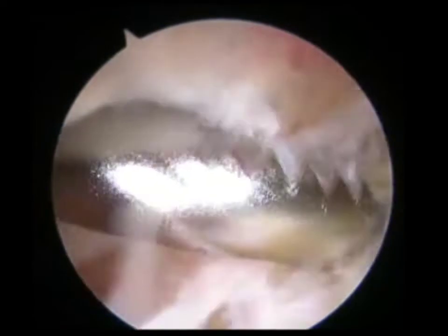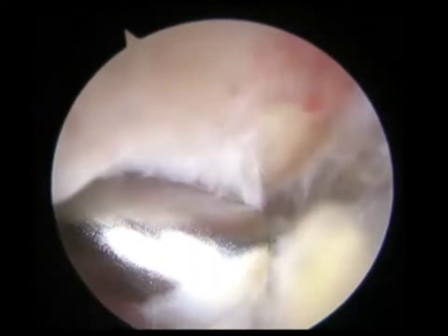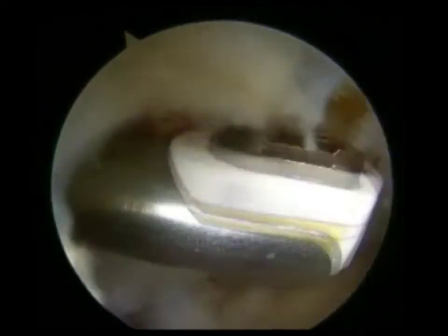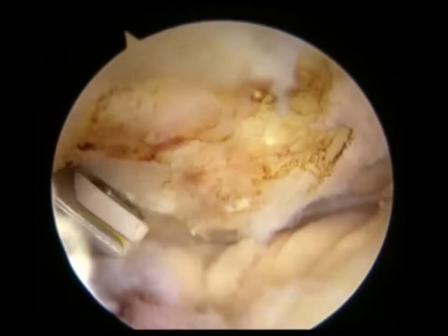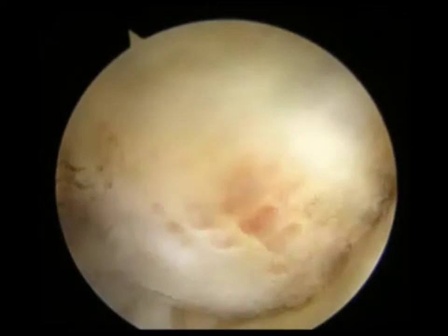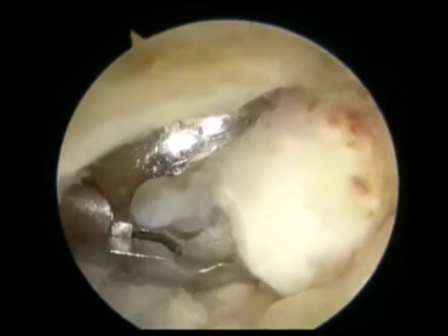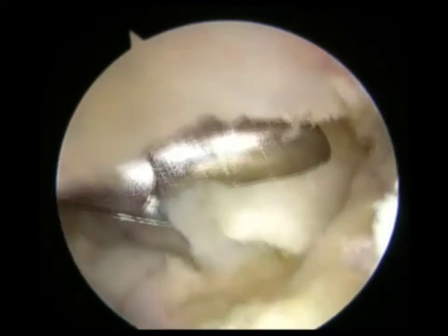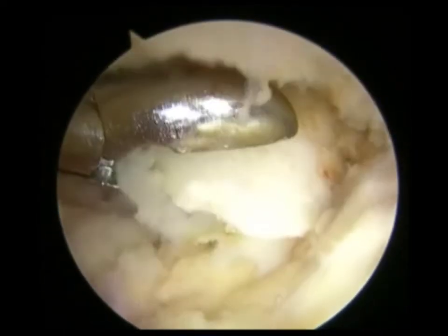After identification of the ossicle, debridement of the bursa around the ossicle is performed with a shaver and radiofrequency device. The ossicle is then peeled out of the bursa with the radiofrequency device and removed by forceps.